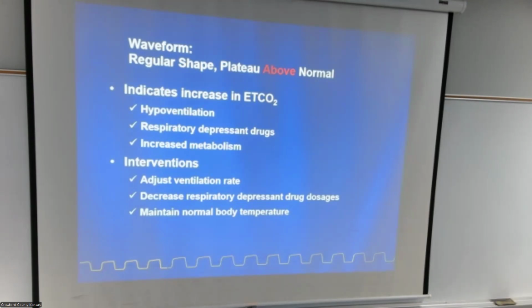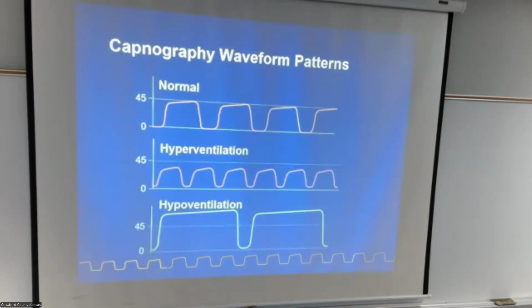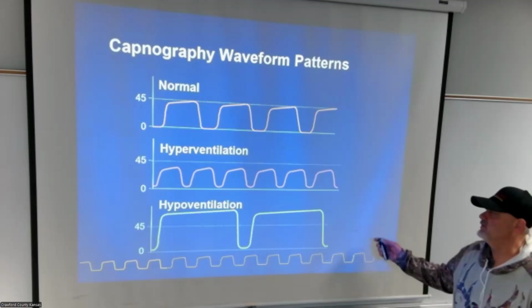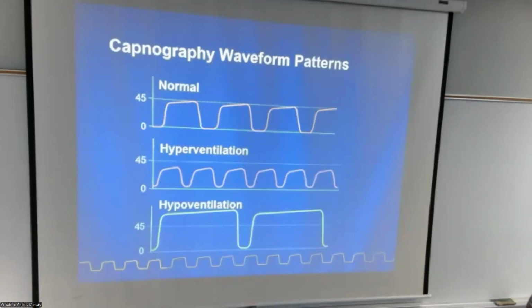Yeah, this is the same thing we did just a second ago. So we have normal, we have hyperventilation, we have hypoventilation. These are our basics that we run off of for waveform capnography.